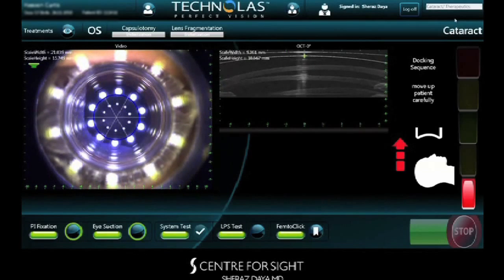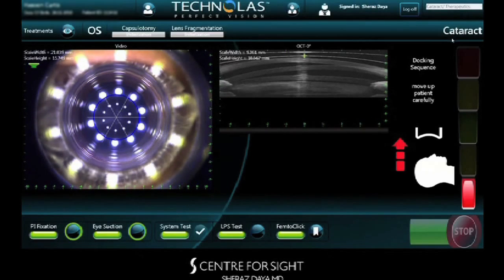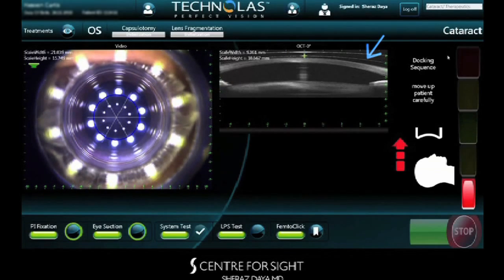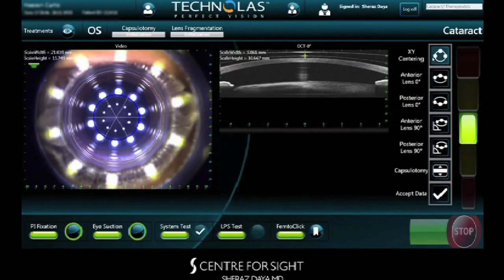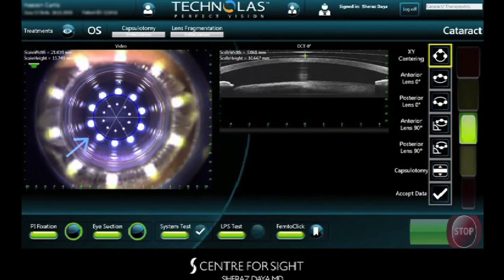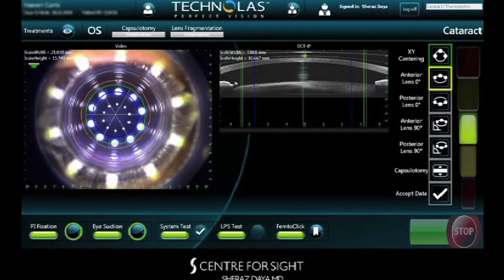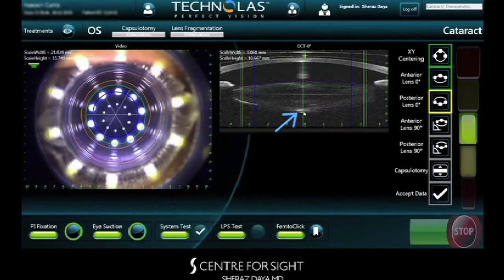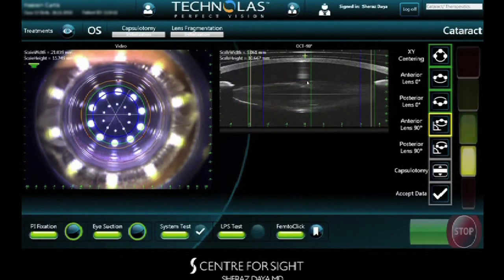The laser images the anterior segment using online high resolution optical coherence tomography. The upper image shows the posterior edge of the interface and immediately underneath the cornea. The anterior capsule of the lens is also shown here. Centration of the capsulotomy is confirmed by outlining the iris. The anterior edge of the capsule is then marked at three points in the 180 degree meridian. The posterior capsule in this meridian is also demarcated, and similar landmarks at 90 degrees are also identified.